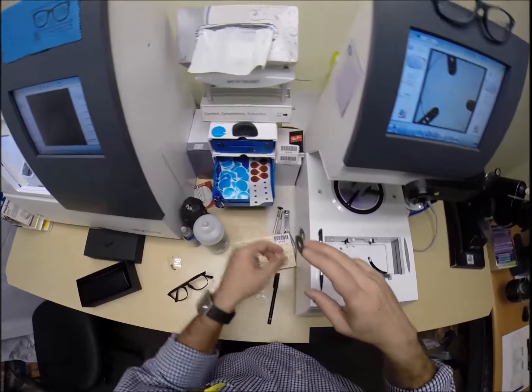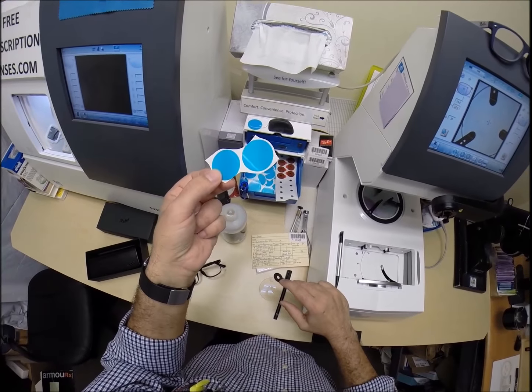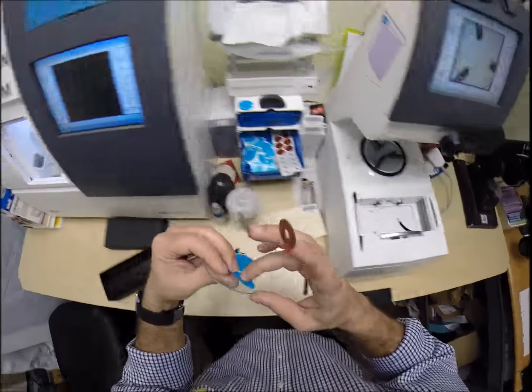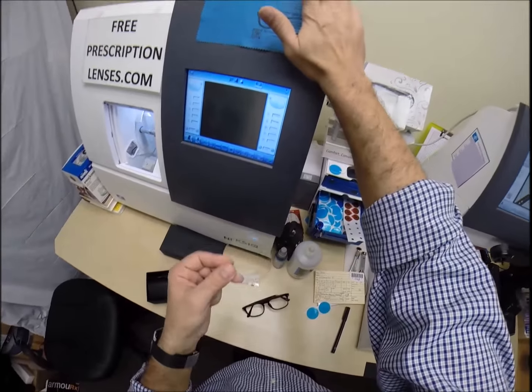I dropped it one millimeter because I like it at the bottom of the pupil, but I don't tell anyone that. But now they've seen the video, they're going to start dotting it at the bottom of their pupil, which is hard to see - especially when you need glasses for seeing up close. So I always tell people to do it in the center. That's what he did.